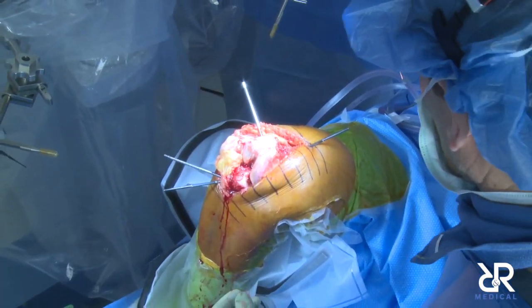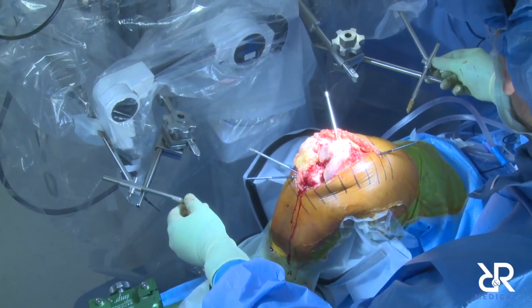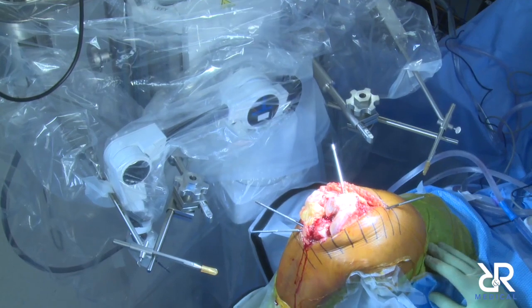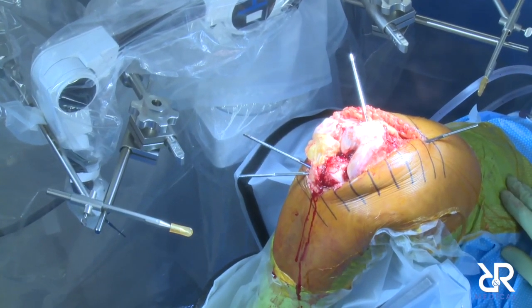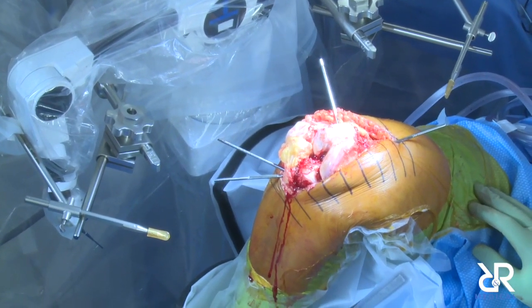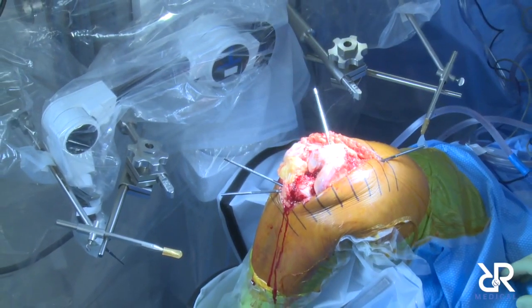And what's really also critical is to set it up the way they say to set it up. When I first started out, I got a little bit in a hurry, and I said, oh yeah, it's good enough. And then, table up, please. Then we didn't get it set up right, and then, no, up. Good. Exactly. That's exactly right.